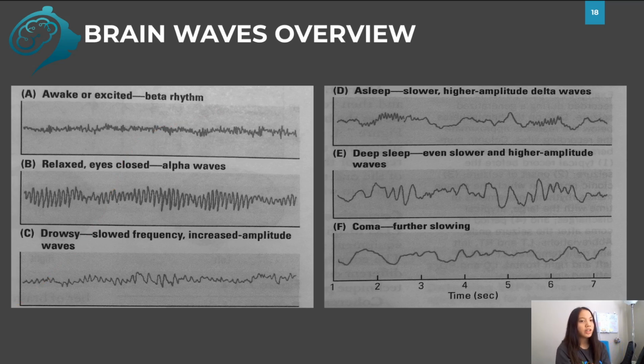And then in contrast, when a person is calm and resting quietly, especially with the eyes closed, rhythmical, larger, slower brainwaves emerge, as shown here in this figure. These so-called alpha waves wax and wane in amplitude at a frequency of approximately 11 cycles per second. And in humans, the largest alpha rhythms come from the region of the visual cortex at the back of the head. So if a relaxed person is disturbed or opens his or her eyes, the alpha rhythm stops abruptly. Not everyone displays alpha rhythms, and some people display them much more consistently than others.